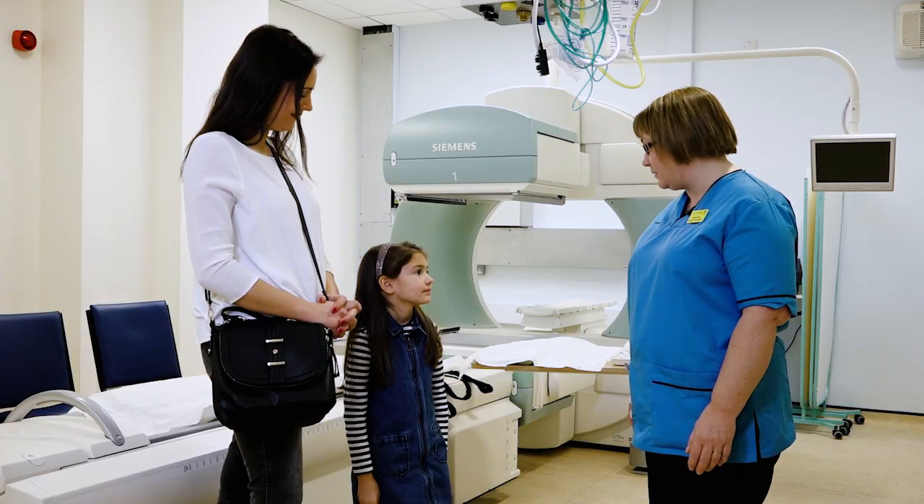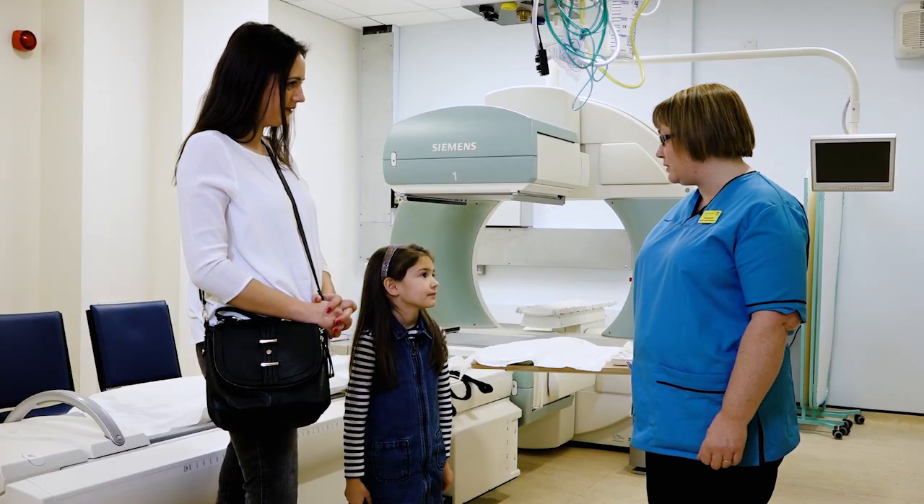Hi Scarlett, I'm Shona. You're here today so we can show you what we do for a DMSA scan. Why would anyone need a test like this? Sometimes when you've not been feeling well, the doctors like us to check that your kidneys are okay.